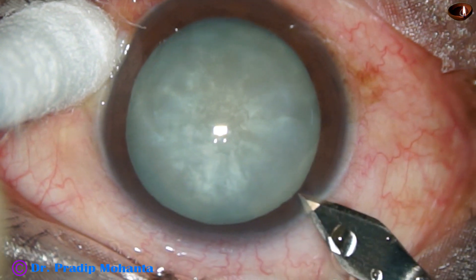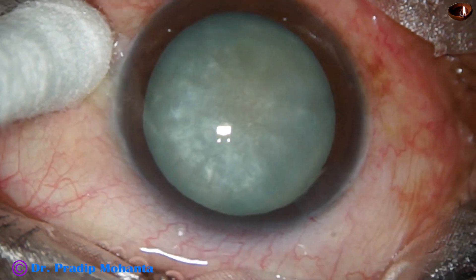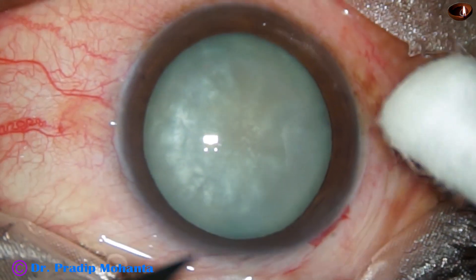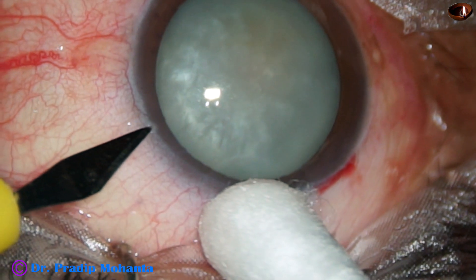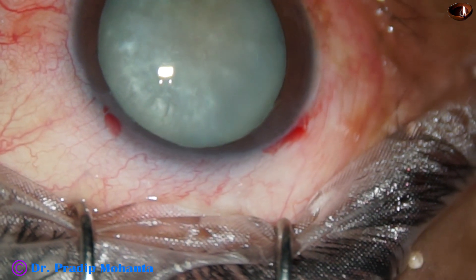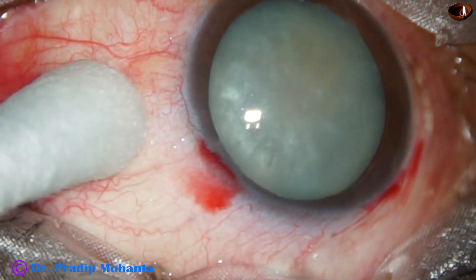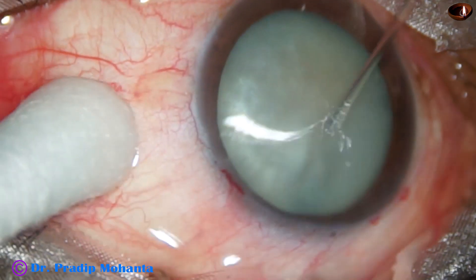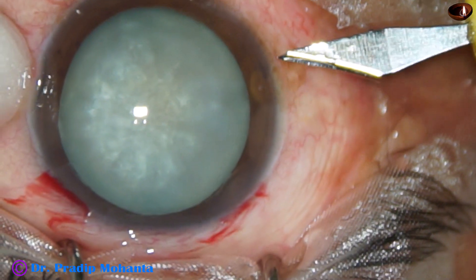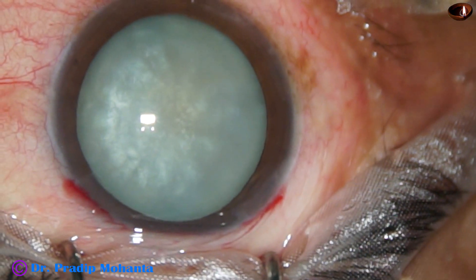This is the main incision with a 2.8 mm steel keratome. One sideport is being made on the left side of the main incision about 3 o'clock hours away, and another sideport is made on the right side at the same distance. The patient is under topical anesthesia and is cooperating quite well.